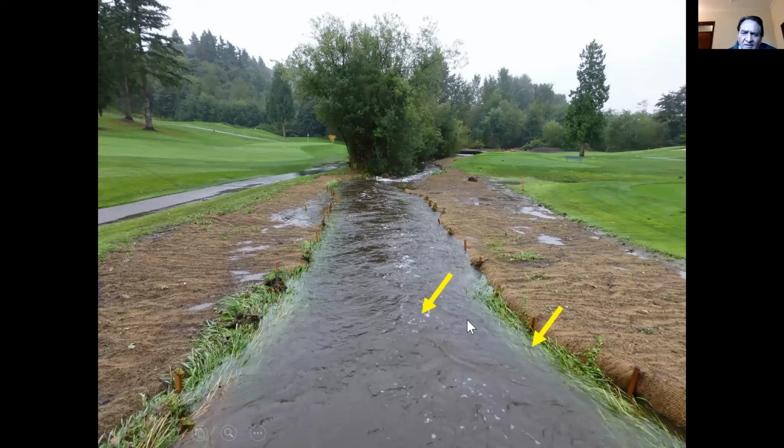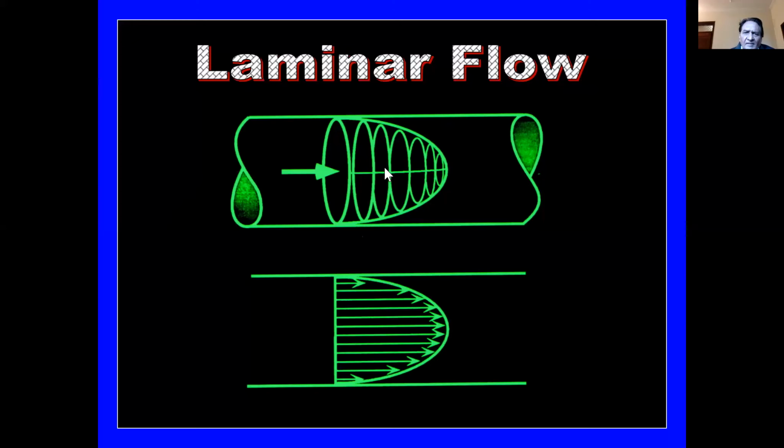So when you take a spectrum, these will be the faster velocities, these will be the slower velocities, and if there's any extravasation of blood or hematoma, it will not show any Doppler shift. It will be static. There will be no Doppler shift. So faster velocities in the middle, slower velocities here. This is called laminar flow or bullet flow.